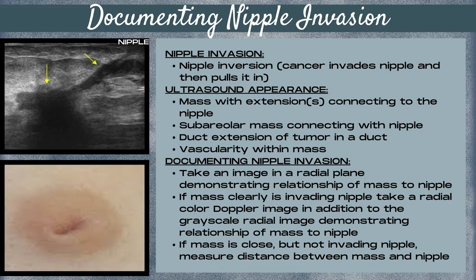To document a mass that's invading the nipple, you want to make sure that you take an image in the radial plane. This is because the ducts course radially in the breast, and this demonstrates the relationship of the mass to the nipple. If the mass is clearly invading the nipple, first take a radial image and then take a radial color Doppler image demonstrating the relationship of the mass to the nipple.